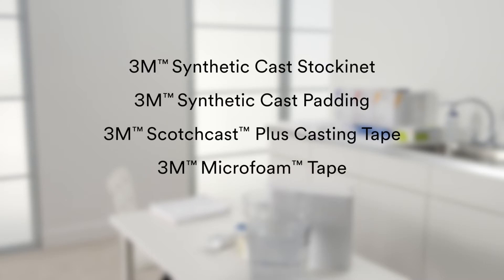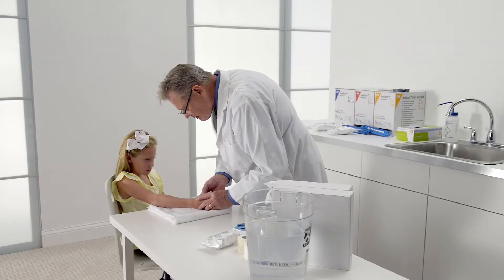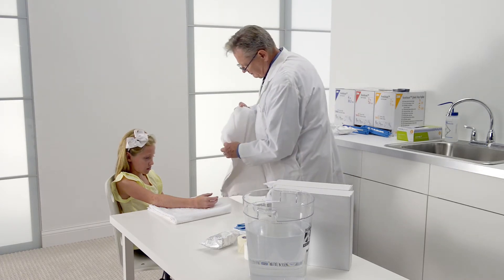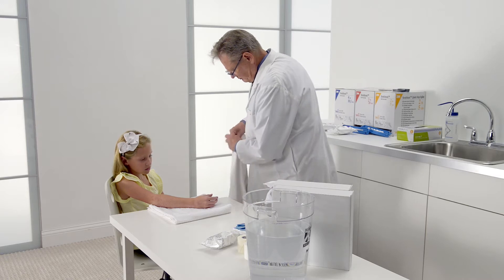Begin by gathering the supplies you'll need. Keep your supplies within easy reach during cast application. Remember to cover any clothing or surface that you want to protect from staining during the application.